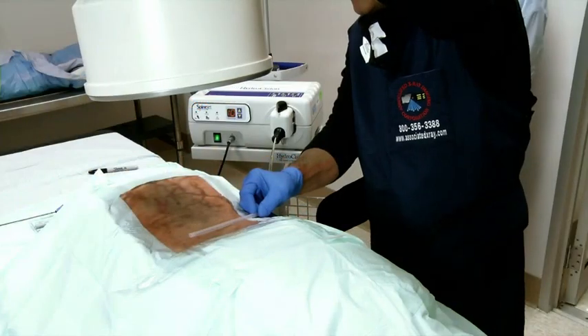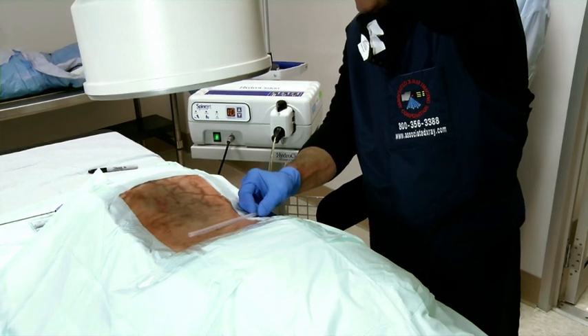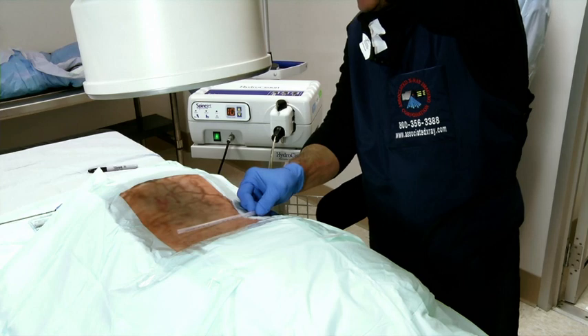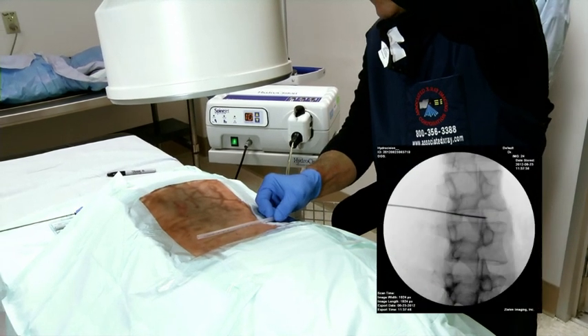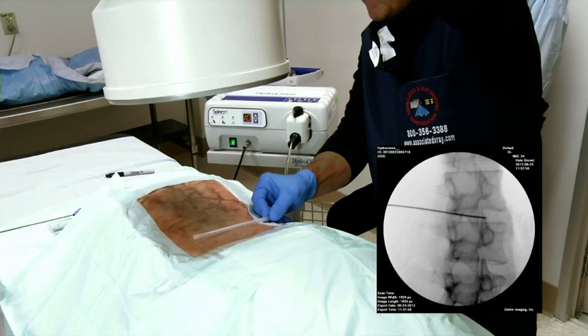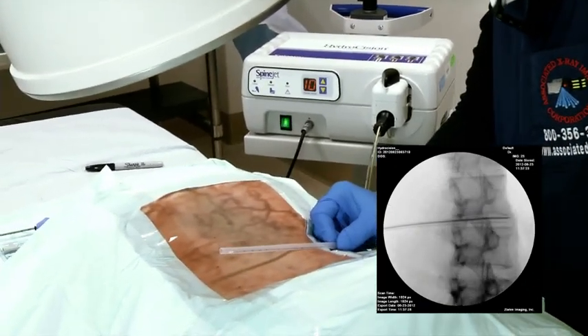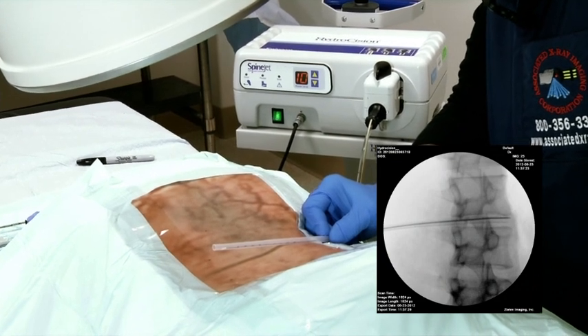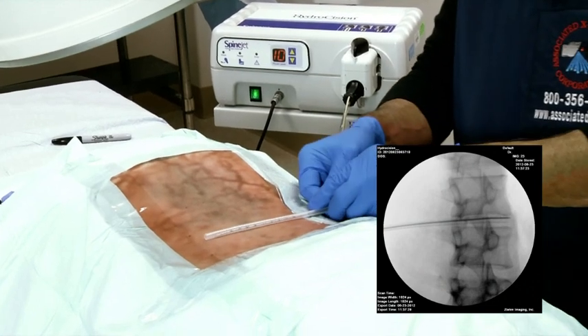The first step in the process is visualizing the disc, done under fluoroscopic guidance. Line up the spinous process, rotating the C-arm cephalad or caudal to line up the end plates. Position the fluoroscope, keeping the end plates parallel. Keep in mind that the oblique angle of your position will depend on the position of the herniation.